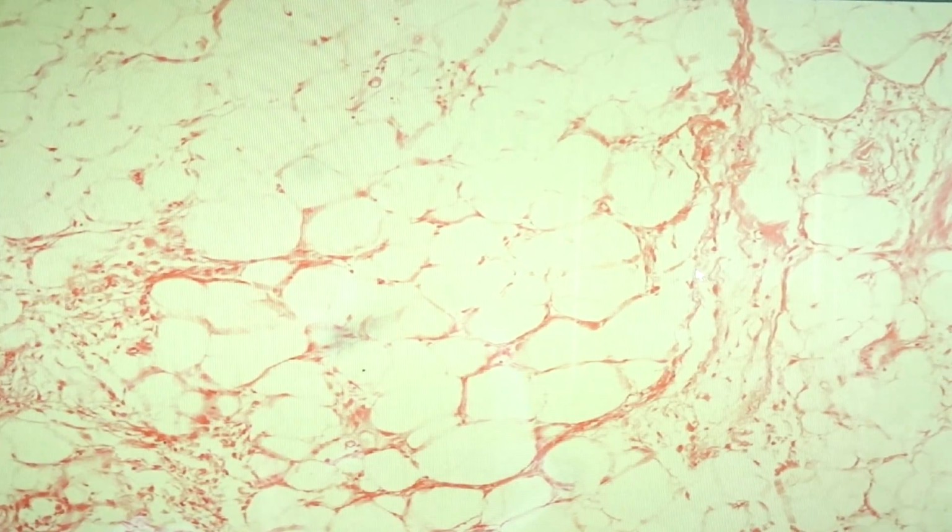These are the normal adipocytes. The adipocytes tend to have abundant cytoplasm, and the nuclei would be indistinct. This would be the abundant cytoplasm, and this would be the nucleus. They are very inconspicuous. Now let's go to the areas that would show the lipoblasts. So these are the areas with the lipoblasts.